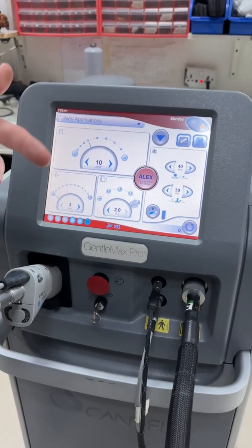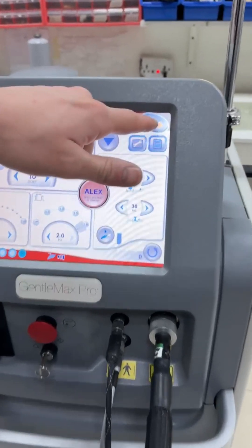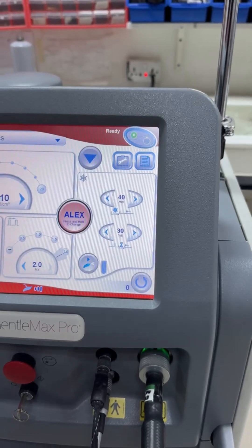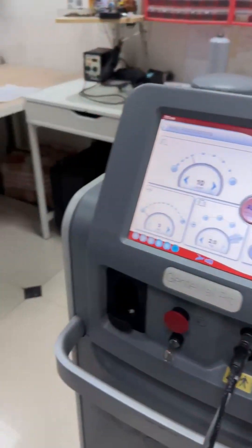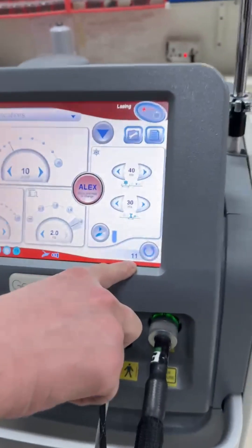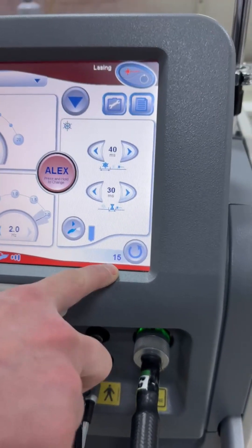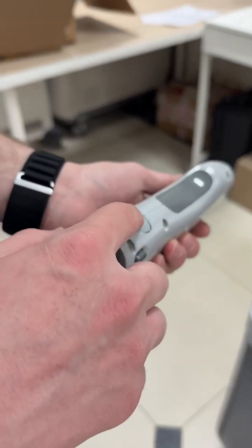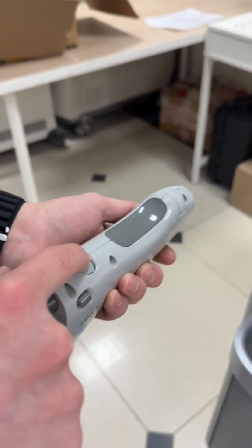In order to use the machine, we need to change its mode from standby to ready. You can either press this button to change it — you can see the counter on the bottom right side. I will now show you another way to change it to ready mode, which is by pressing this button on the handpiece.